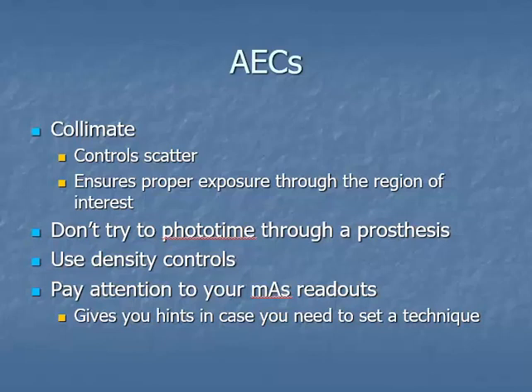So don't try to phototime through a prosthesis. Set a technique if you can. Use your density controls where appropriate. You might have to use a +1 or a +2 if you've got relatively small bone that you're trying to put over an AEC. And pay attention to your mAs readouts.